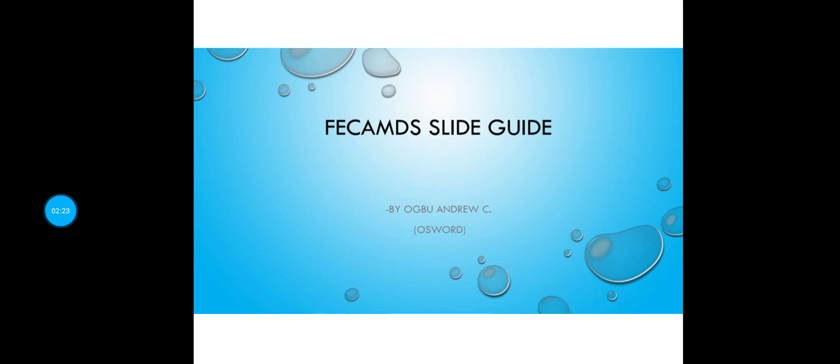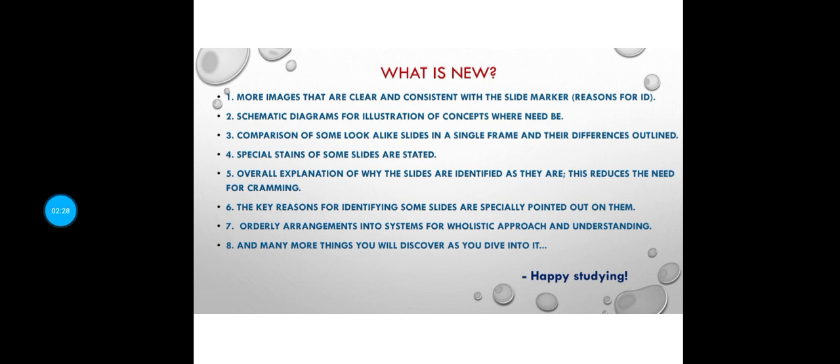So what should we be expecting from the slide guide compilation? What is new? Number one, more images that are clear and consistent with the slide markers, with reasons for ID. 2, schematic diagrams for illustration of concepts where need be. 3, comparison of some lookalike slides in a single frame and their differences outlined. 4, special stains of some slides as stated. 5, overall explanation of why the slides are identified as they are.